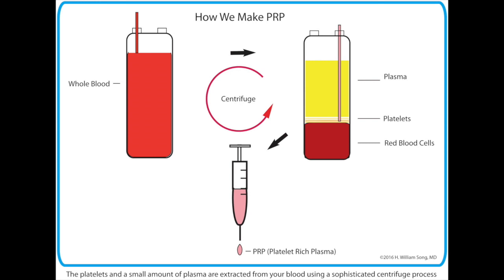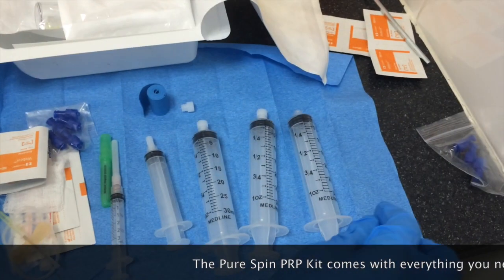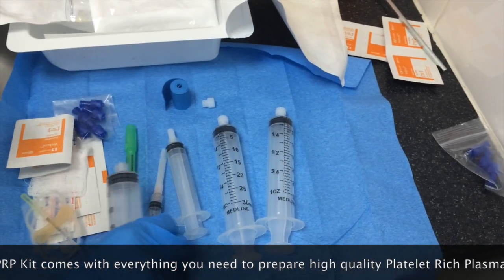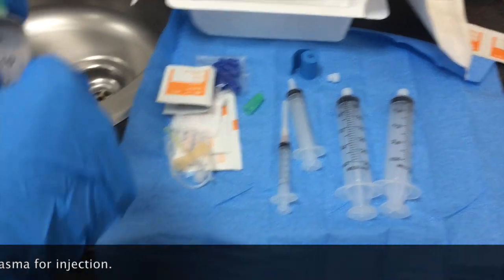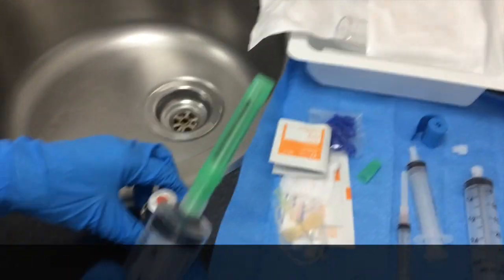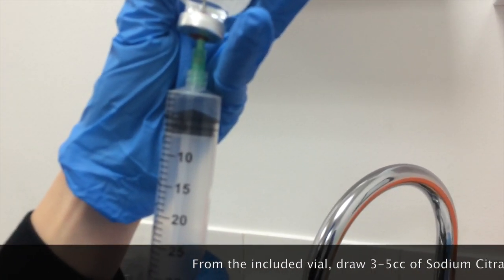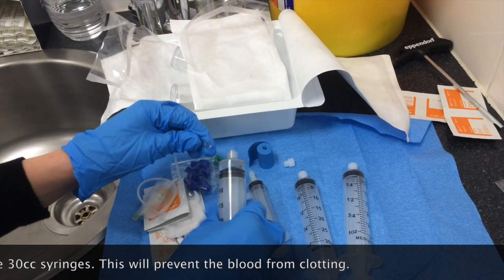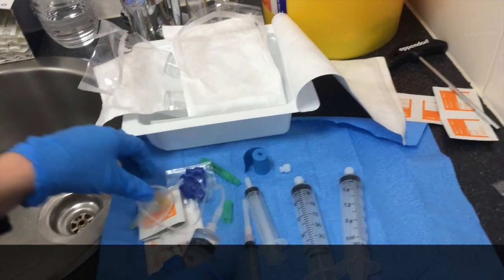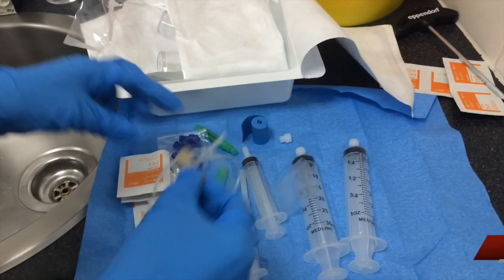Hi, Dr. William Song here to talk about how to make PRP using the PureSpin PRP kit. Put that needle on it, and just draw up about three cc's of air into the syringe. Okay, so now you've got that all ready, and then you're going to get PRP on it.